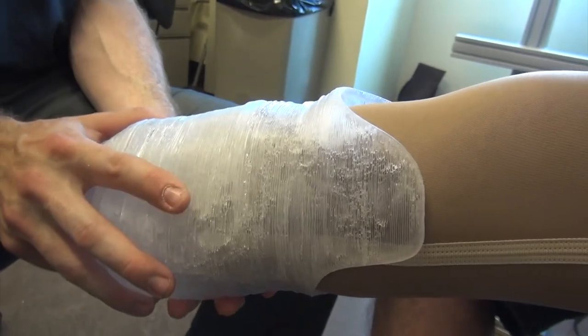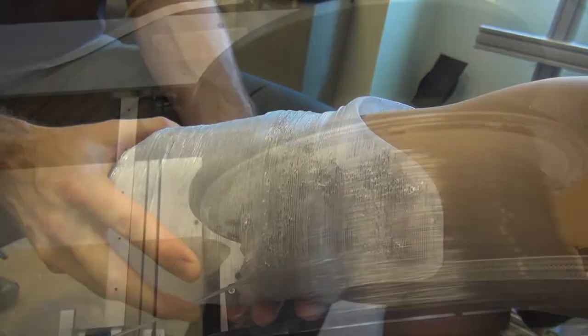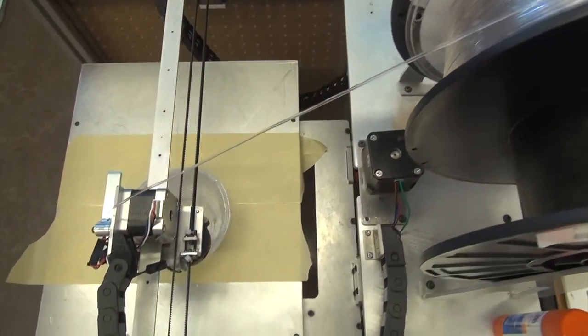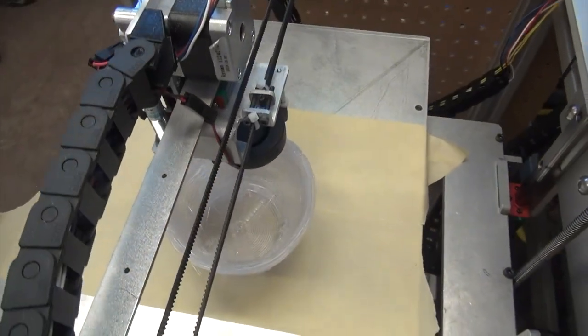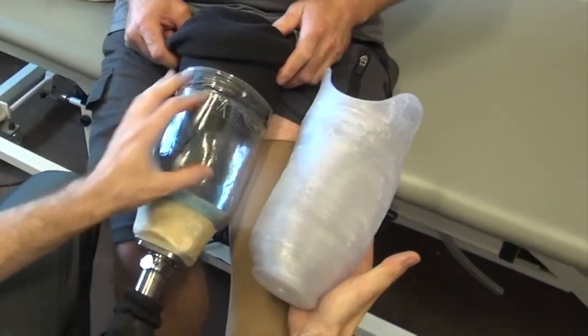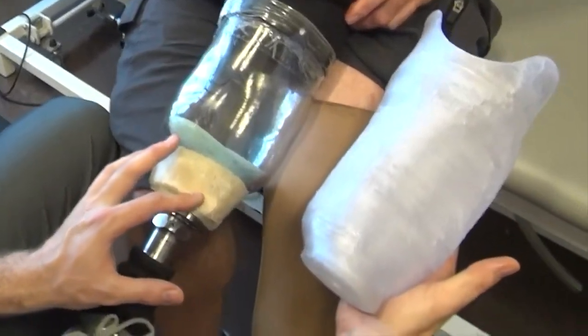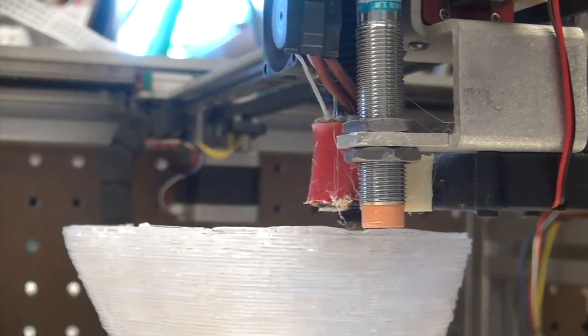Dr. Mayo says there are a lot of people who are building prosthetics, but Sunnybrook is the first to study how safe, effective, and patient-friendly 3D printing is. For now, the focus is on testing the technology on patients with lower extremity limb loss. If successful, it could offer prosthetists one more tool to work with and skills around what could very well be the technology shaping the future of their field.